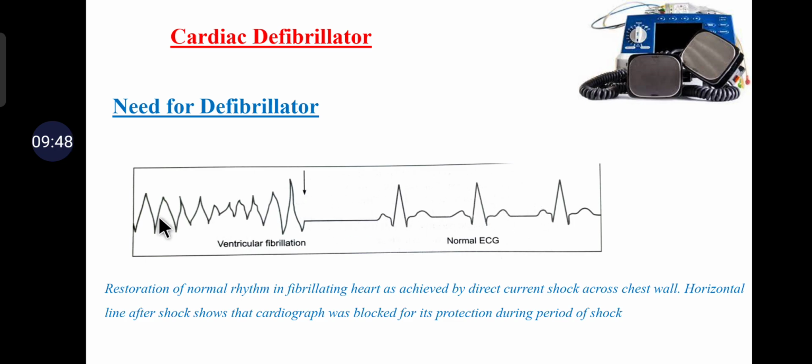Here the heart is having some problem, so once again we give a high voltage shock, and we get a normal ECG pulse. The shock can be delivered to the heart by means of electrodes placed on the chest of the patient, which is external defibrillation, or the electrodes may be held directly against the heart when the chest is open, which is internal defibrillation.